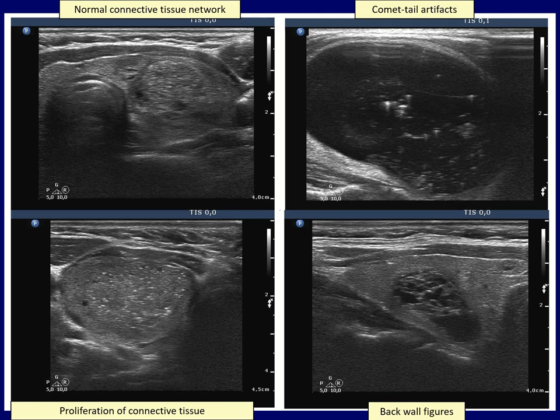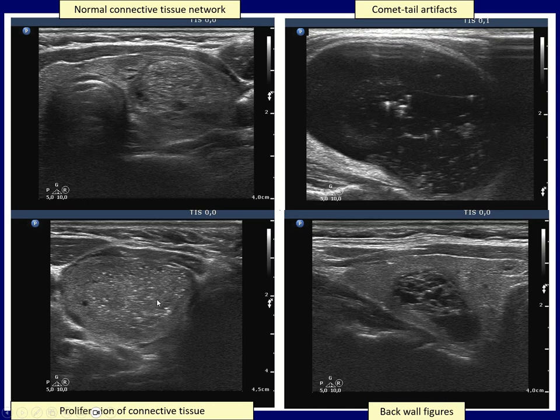The left upper case presents the normal connective tissue network, which is a bit more pronounced within the nodule. More concerning is the left lower nodule, which shows fibrotic changes within the nodule. Depending on the angle between the ultrasound wave and the anatomical structure, a fibrotic bundle can appear as an echogenic line or echogenic granule.